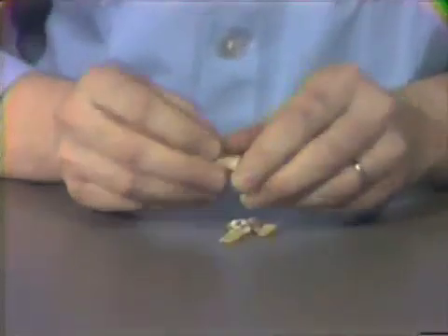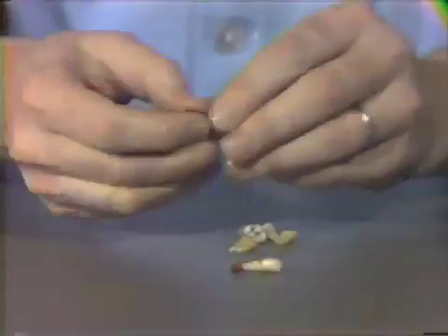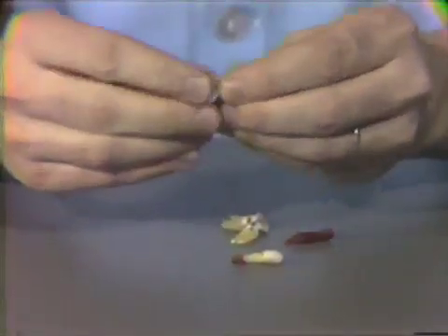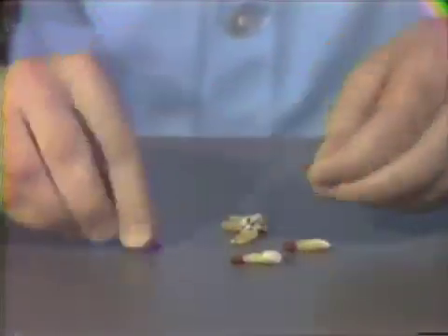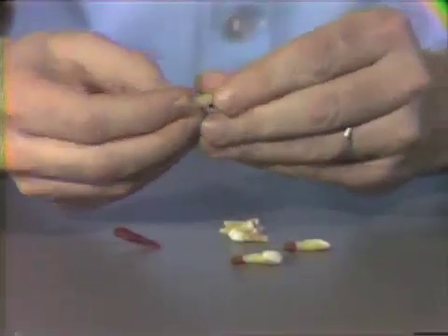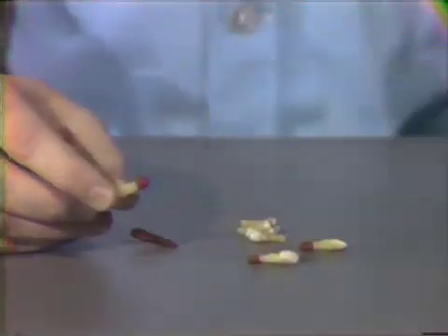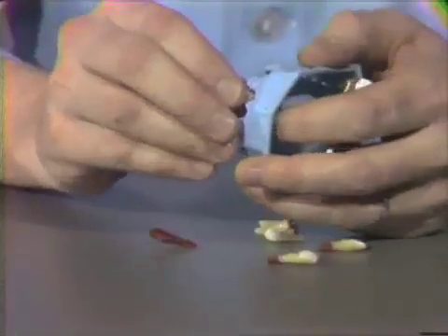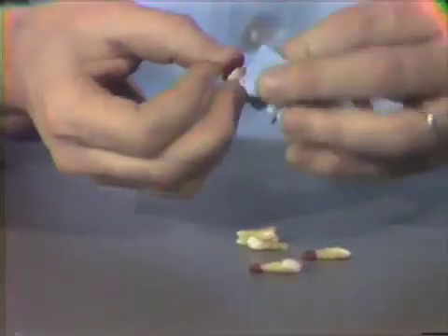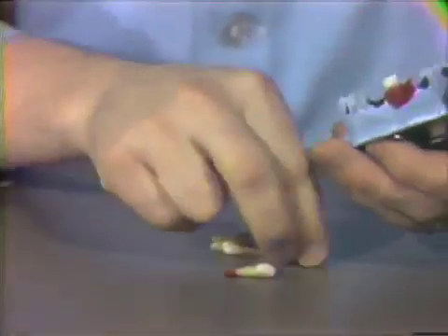The next thing we'd like to do is to prepare the teeth for mounting in the typodont. What we need is some red wax. We'll take some red wax and place it on the apex of each tooth to be mounted. The purpose of this is so that we can see the apex of the tooth much better on the radiographs we're going to take later after the teeth are mounted. We'll then place the teeth in the proper position on the typodont, and with red wax or perhaps even orange sticky wax, we can put these in place.